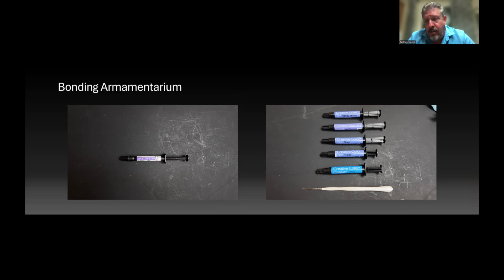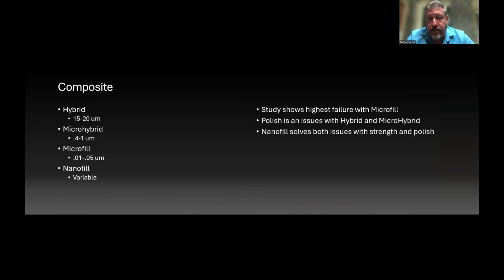When we talk about staining and glazing, I use the Creative Color Tints by Cosmodont to do my staining and glazing and characterization. You can use these if you make provisional veneers. You can color your veneers with these things. All my temporaries, no one goes home with a tooth number 9 temporary that doesn't look like number 8. I do all my correction there. Patients really appreciate it.